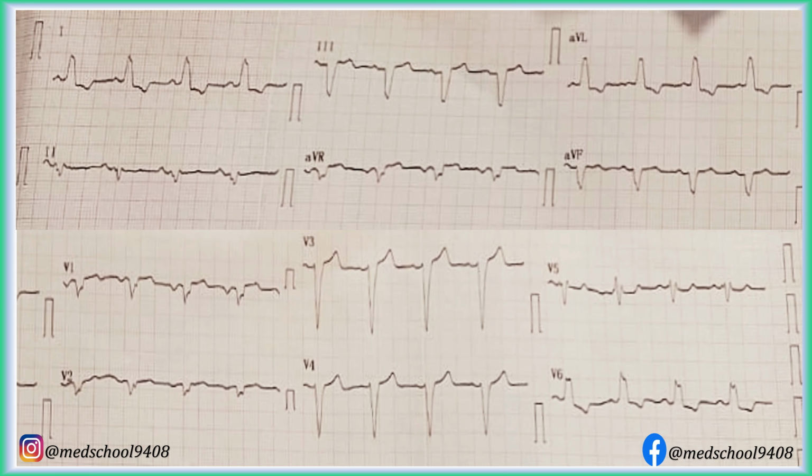In this ECG, there is R pattern in lateral leads and notched QS pattern in right-oriented leads. QRS duration is more than 120 milliseconds. Hence, these changes represent complete LBBB.